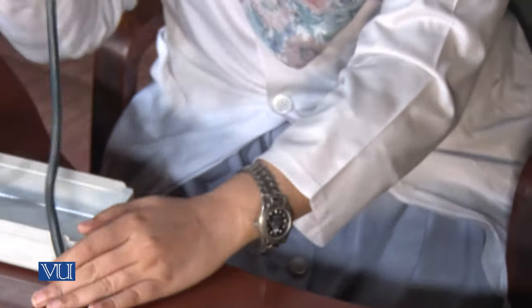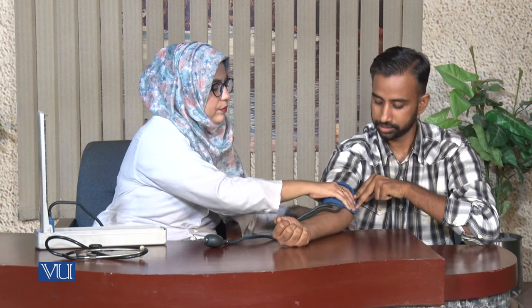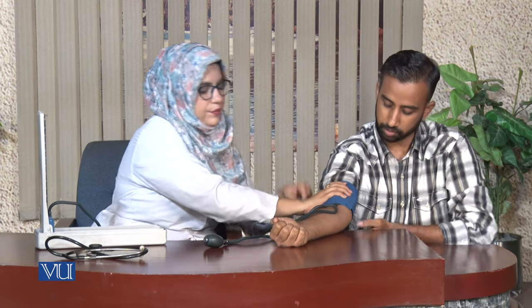First of all, use a properly sized blood pressure cuff. The length of the cuff's bladder should be at least equal to 80% of the circumference of the upper arm. Wrap the cuff around the upper arm with the cuff's lower edge 1 inch above the antecubital fossa.